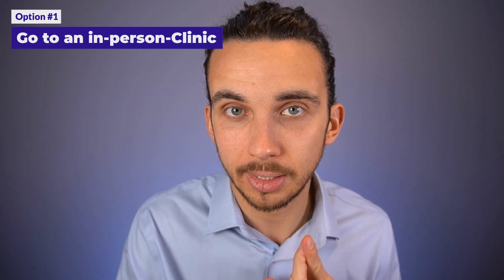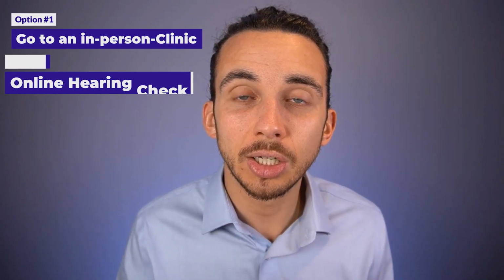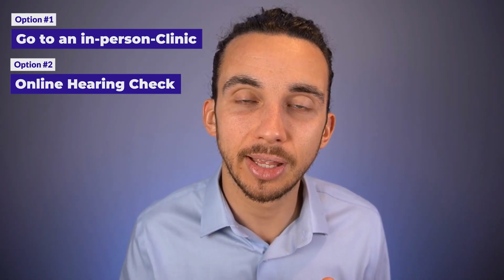If you have a hearing loss, or if you're not sure if you have a hearing loss, we want to test or measure your hearing. From that, we can program the AirPods Pro, or we can recommend certain hearing aids that can do the job. If you have not yet had a hearing test, or you want an updated hearing test, then you have a few options. Option number one, go to an in-person clinic.